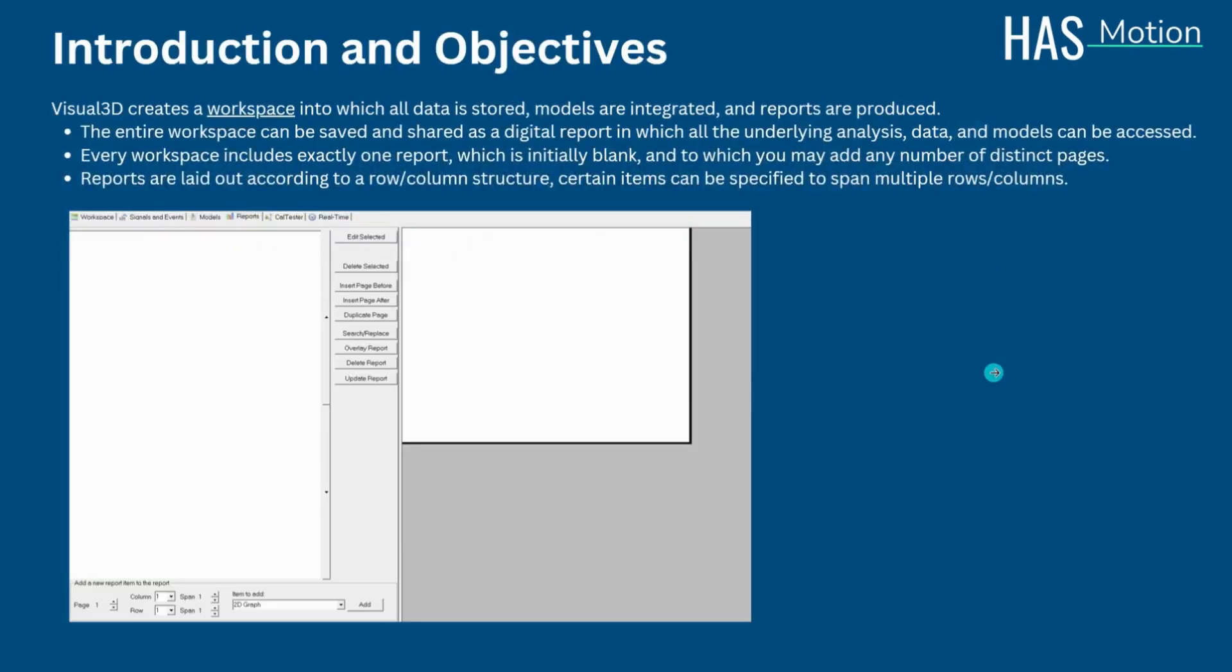After completing the necessary analysis of your data, it is important that you are able to display the information gained. The report is created within the Visual 3D workspace, where all data is stored and models are integrated. The entire workspace can be saved and shared, so all underlying analysis can be accessed.